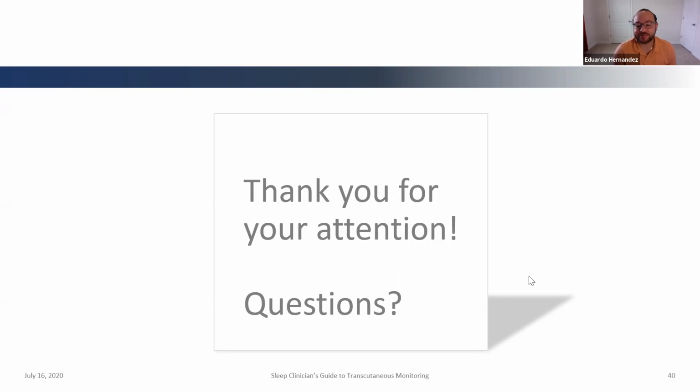No worries. You do not have to wait 6 hours. You can remembrane, you tell the monitor that you've remembraned, and it will ask for calibration at that point. So go ahead and do a calibration. That's going to take you 5 to 10 minutes.